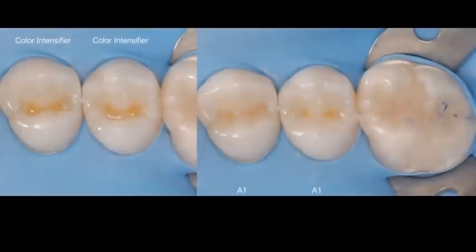And before I start adding my lingual cusp, I'm going to add a little bit of a tint. And this tint, you can see I use either gold or ochre, depending on the brand that you buy. I normally use one made by Kolor Plus, and it has one that is called gold. And this is what you're seeing right here. You can see that little gold color that this stain has, and I apply just a little bit in the center, in the areas where I'm going to create my pits to create a well-defined occlusal anatomy on my restorations. Again, I apply it before I do my final lingual increment so that I can hide a little bit of the yellow.